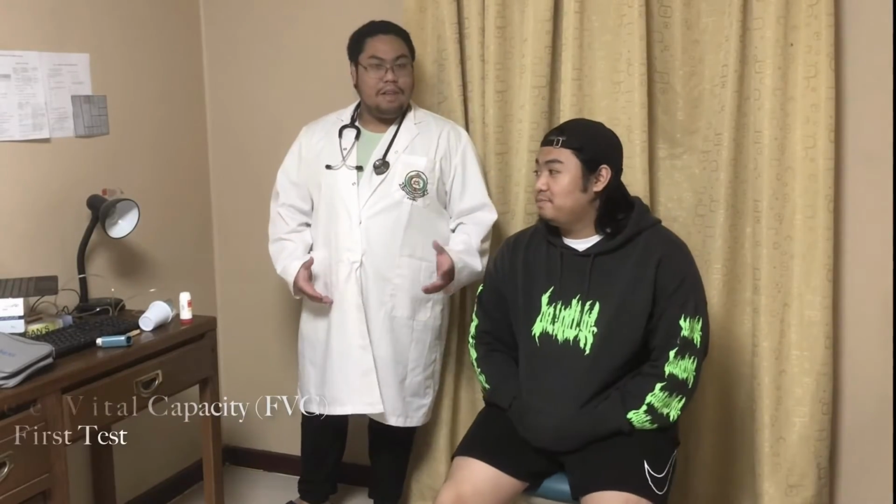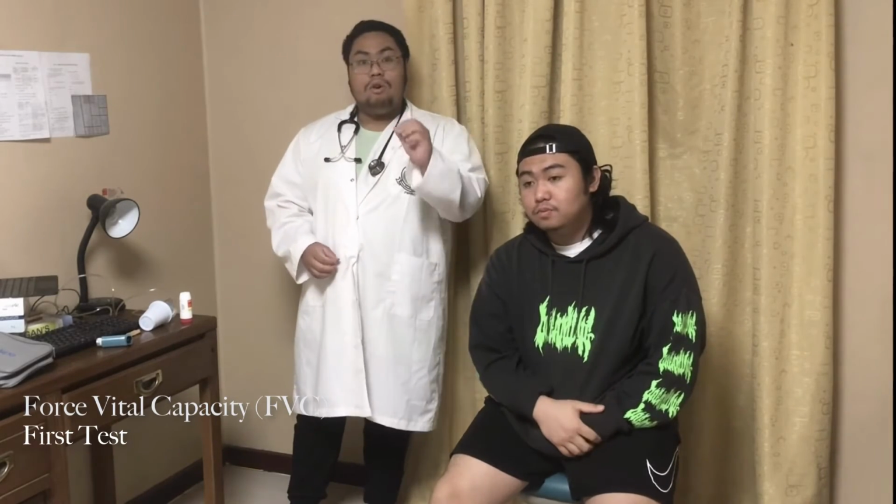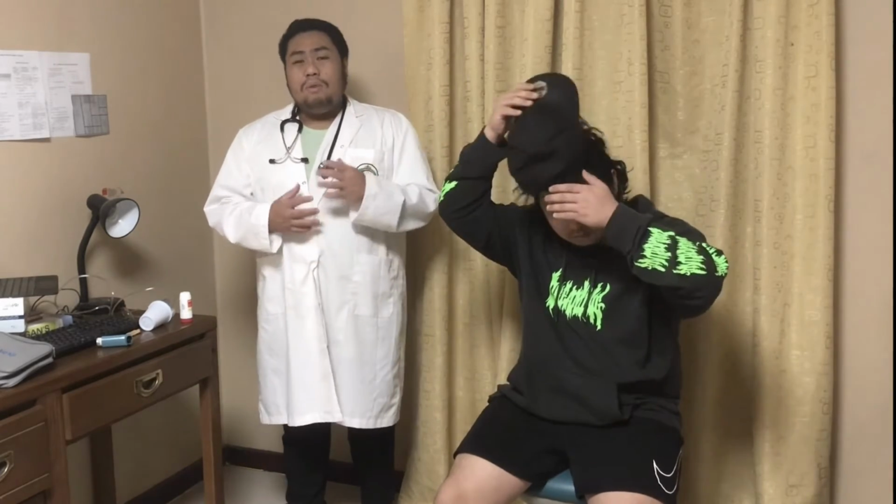After introducing yourself to the patient and explaining what we're going to be doing today, before we get started, we need to coach, instruct the patient, and make them practice it. Giving them a rehearsal with the memorization of this test will increase the accuracy and will help the patient be more comfortable with the physician and with the test that's at hand.